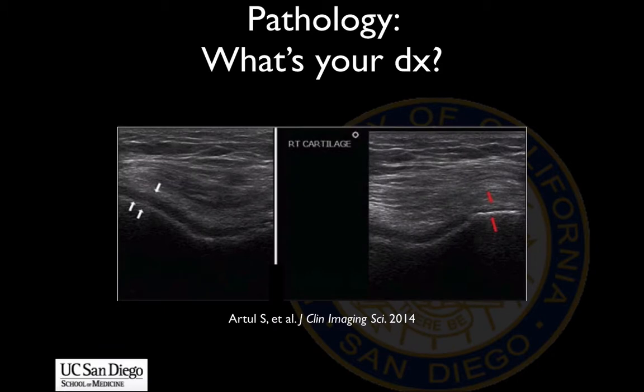Okay, so here's a patient that presents to clinic that has many months of knee pain of their right knee without any history of trauma. No fevers, normal vital signs. So you place the ultrasound after doing a physical exam. And here, as you look along the lateral aspect of the knee, you get that nice trochlear view with that uniform anechoic signal of that portion of the joint. However, as we move and look towards the medial aspect of the joint, here we can see an obliteration of that anechoic space and increased echogenicity along the joint line. And these findings are consistent with severe osteoarthritis.